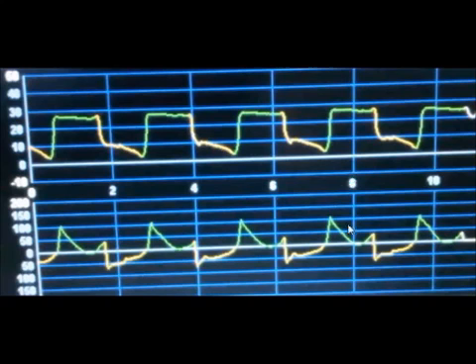And what else you might see is high tidal volumes. So that's the bad thing about pressure control. Patients sucking in so much, you're going to have a lot higher tidal volumes too until they wear out. So let's take this to the ventilator simulator and show what happens.